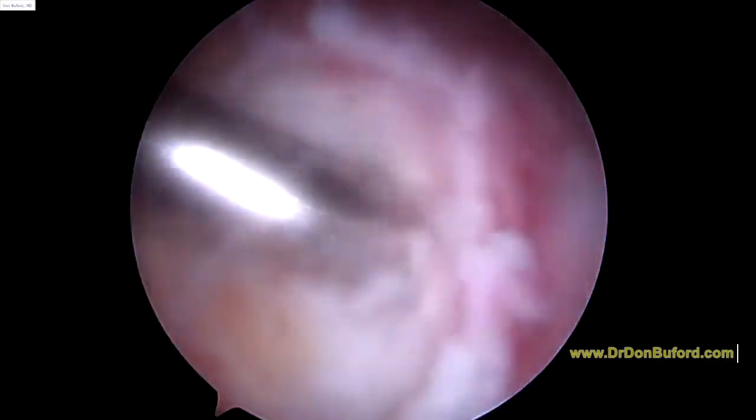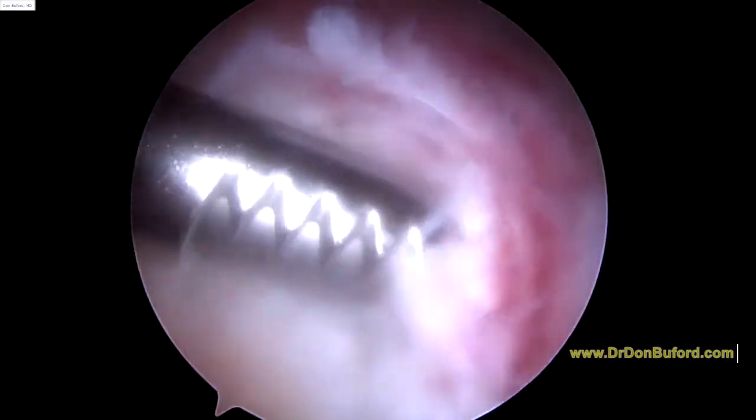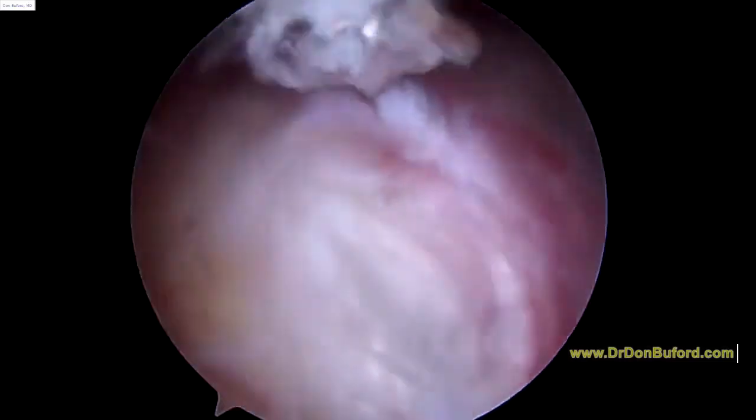That little area where you had the calcium is now gone. We're going to place what we call a side-to-side suture in to seal that over.